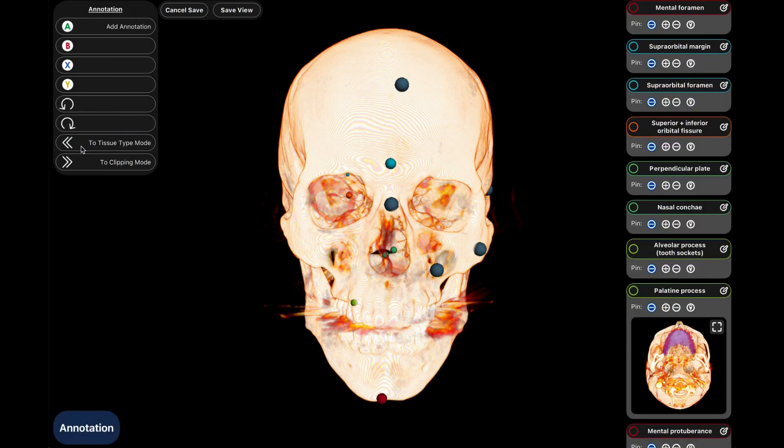You will know which mode you are in by looking at the top of the control panel, as well as the mode menu at the bottom left of the screen.